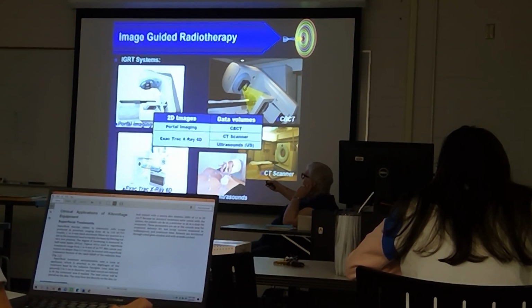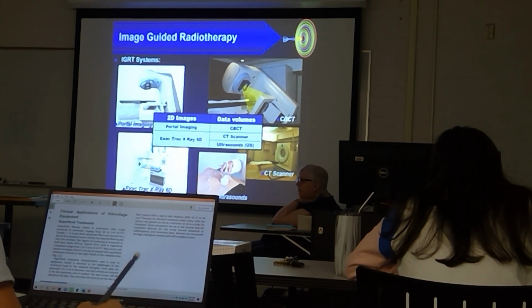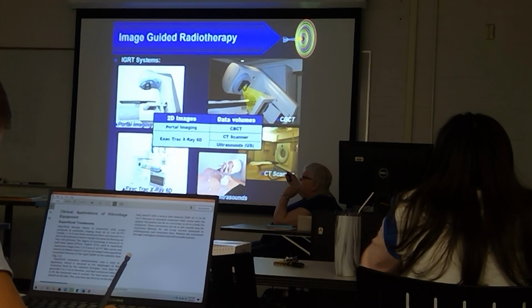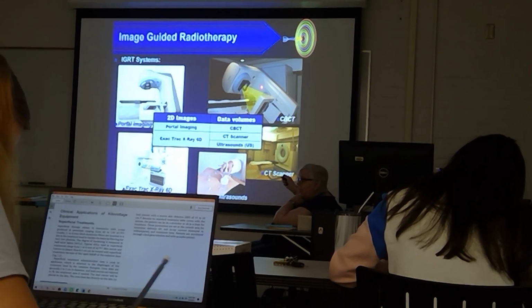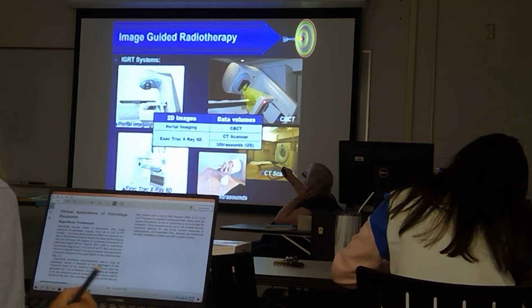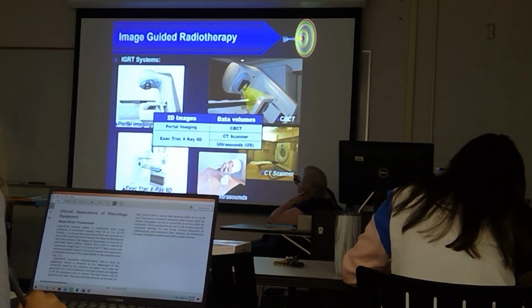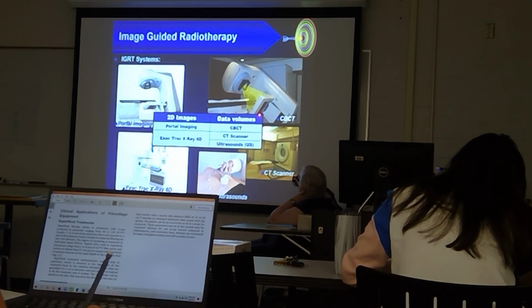That's what confuses me, CBCT is the same too, what's the word I'm looking for? You're using the same equipment on both of them, so what exactly makes them different? The cone beam CT is kV images. It's like doing a CT image, like doing CT slices. That's exactly what it's doing. Isn't that coming from the gantry? The kV imager, I thought, was something different. No, this is actually the MV imager. Although it says cone beam CT, this is not a cone beam CT. This is an MV image coming from here.